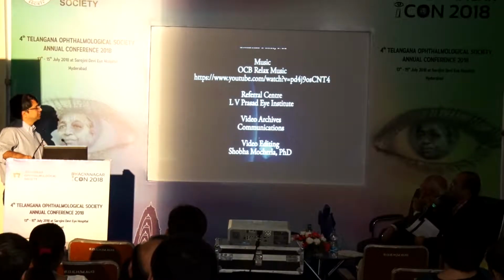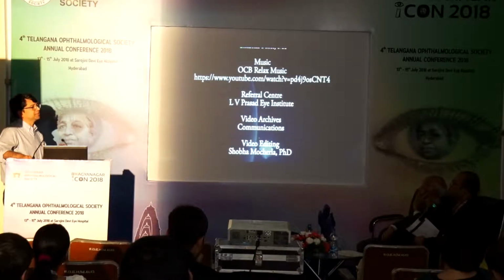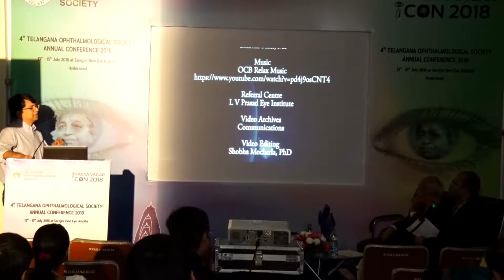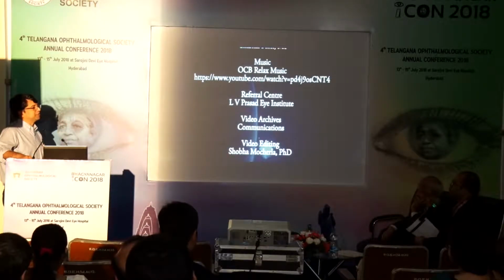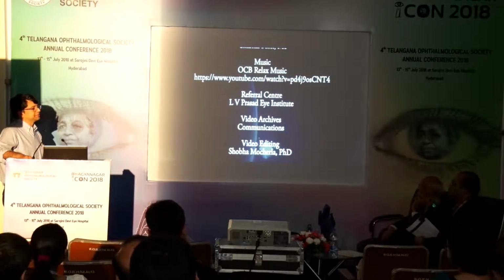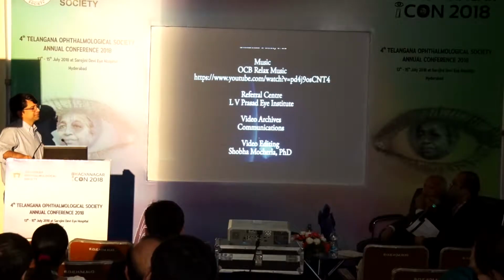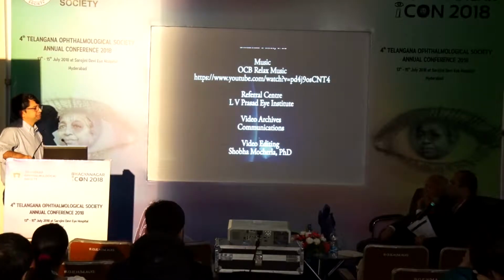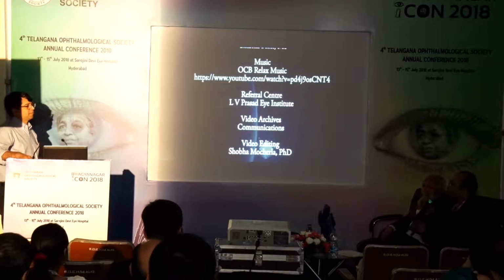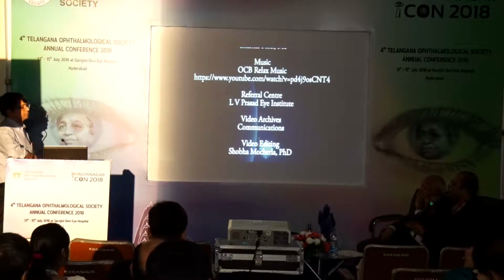Since I have performed a very delicate superficial keratectomy, I just want to remodel the tissue, thereby you have much better transparency. And as we know, the cornea, the air-tear film interface, is the most important. So I don't want any haze on the anterior surface, thereby you have fewer aberrations, and the child, particularly during neuroplasticity, has error-free vision, thereby we can maximize their visual potential. I think this is very important, particularly in kids. If we start them early on amblyopia therapy, it would have a huge impact as far as their amblyopia is concerned.